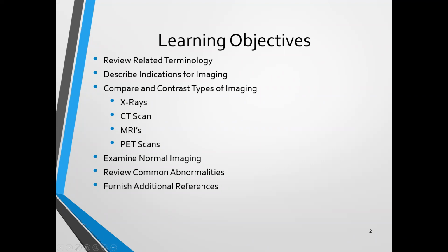Those would be the 4 major categories of scanning that we're talking about. I deliberately did not spend time on ultrasound. I could have, but the time limitations for this presentation really precluded us from taking a dive in that direction.